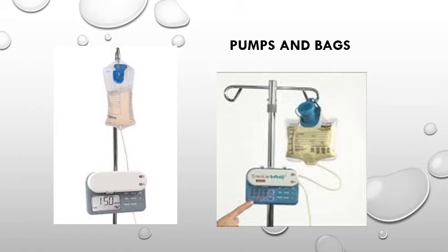If a person is unable to tolerate a tube feeding by bolus method, they have nausea, vomiting, diarrhea, belly pain, then the doctor will order a gravity feeding. If the person is unable to tolerate a gravity feeding due to the symptoms above, they will order a pump feeding. For a pump feeding, medications and water flushes are administered by the bolus method by pausing or stopping the pump during that procedure.